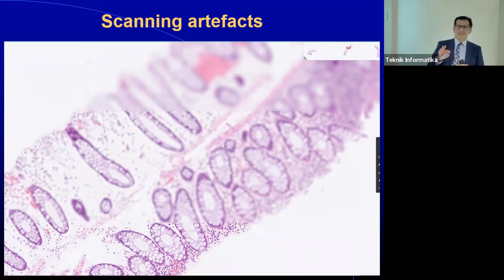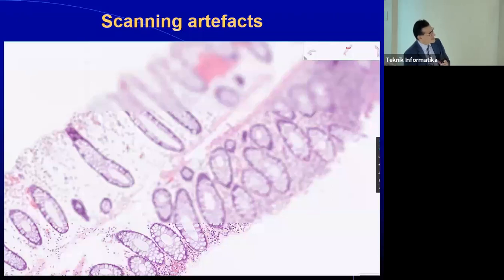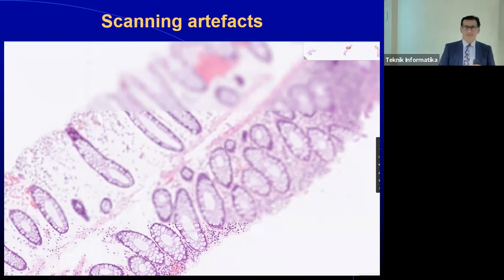Now, what is really good about this picture is that not only is this out of focus compared to this here, but this is out of focus, or it's different focus compared to that. So in one image, we've got three different levels of focus. We've got proper focus, we've got slightly out of focus, and we've got really out of focus. Right? What's your computer going to do when it sees that? You know, I don't know. So that's one of the things that may be a confounder.